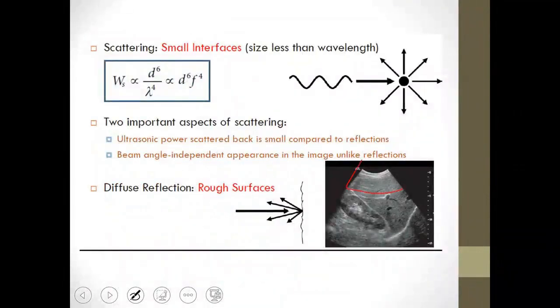Here, there is indeed a part related to echo texture, which is actually a result of isotropic scattering. It entails small particles compared to the wavelength of the ultrasound. This shape actually includes a part like the diaphragm, which is a smooth reflector, giving a bright signal, or hyperechoic signal. This occurs because it is a strong interface.